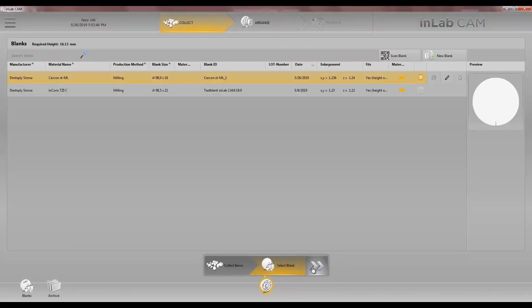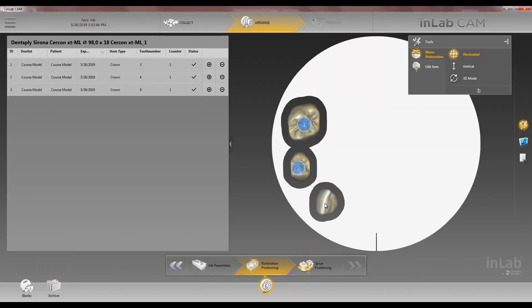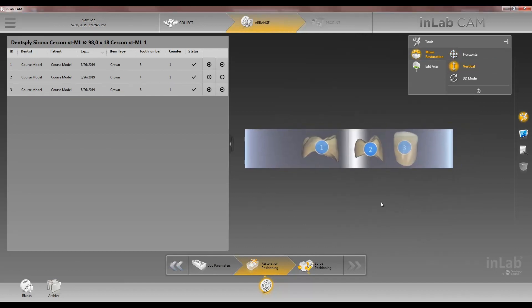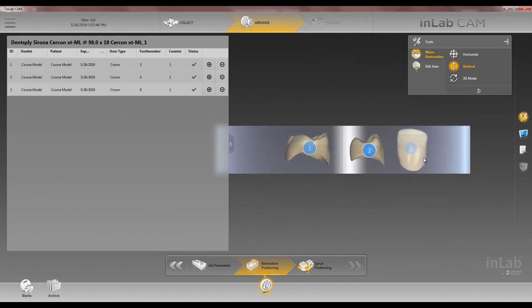We'll arrow forward. Position our restorations however you want in the disc. You can also go horizontal first, then vertical. Here you can see the different transitional layers in the disc. If you want more incisal you'll raise it more to the top of the disc; less incisal you'll bring it down.